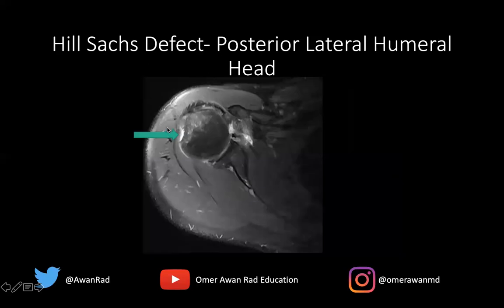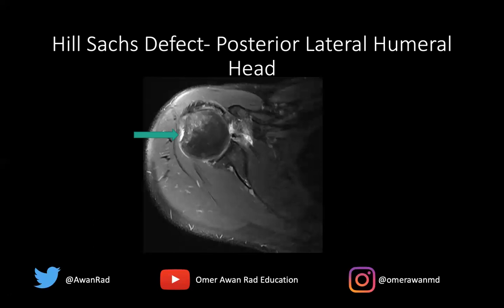This is what a Hill-Sachs defect looks like along the posterior lateral humeral head on an axial image — anterior, posterior, medial, lateral. There's a defect here: we lose the normal sphericity of the humeral head. There is also bone marrow edema along the lateral aspect from the contusion. Importantly, we only call this on the more superior axial slices where you can see the coracoid process of the scapula. As you scroll inferiorly, there is a natural posterior lateral defect, so we never call a Hill-Sachs lesion on those inferior slices.